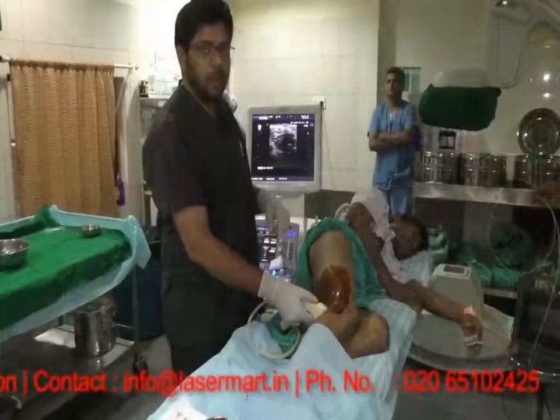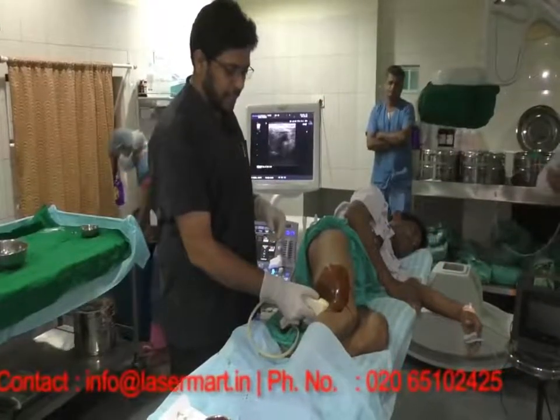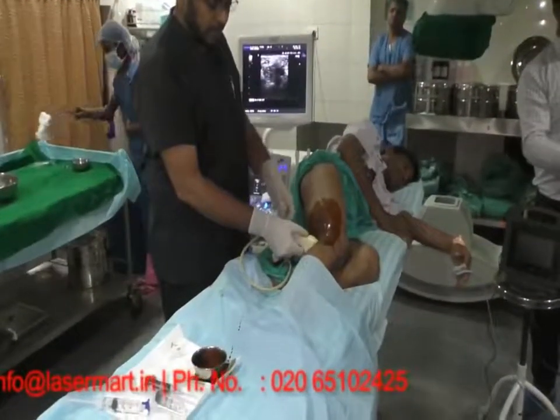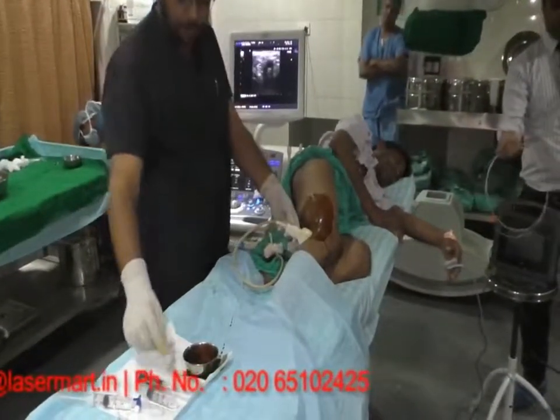Now we are going to demonstrate how we do a sciatic block at the popliteal fossa, so that the endovenous laser treatment should be pain free for the patient.